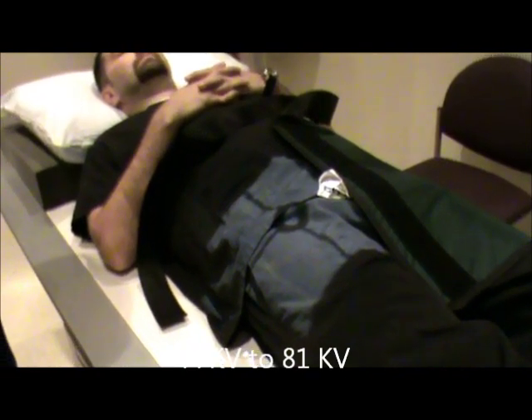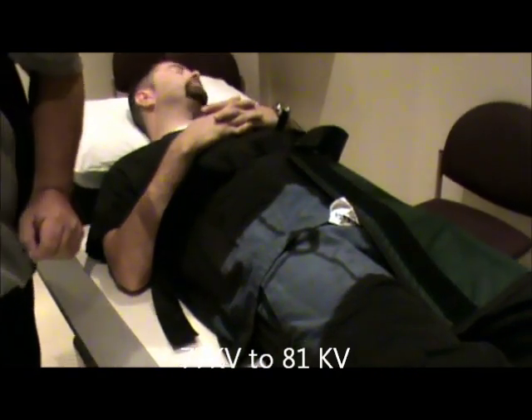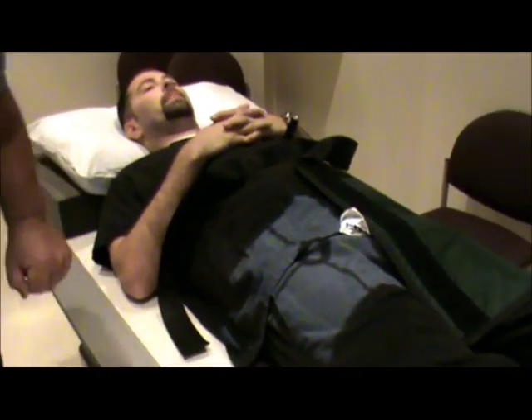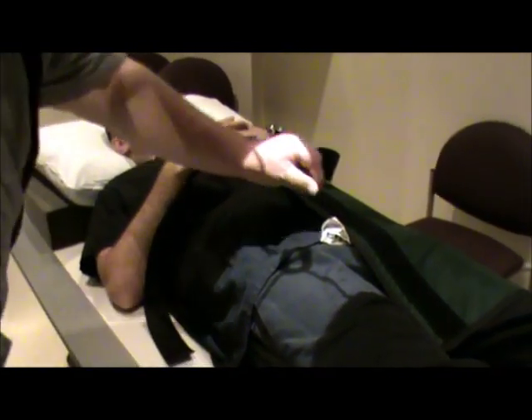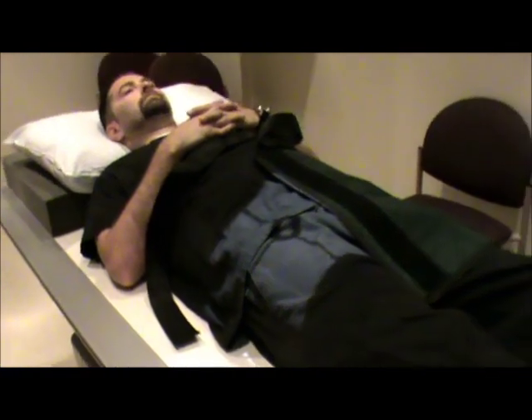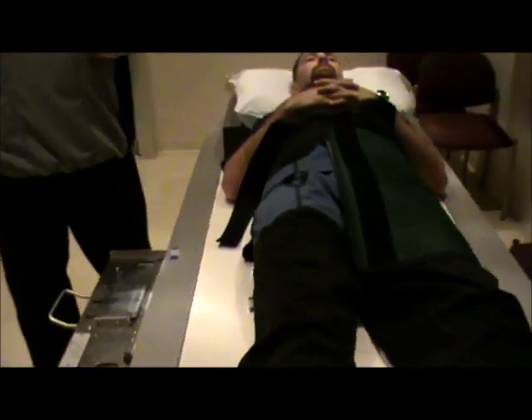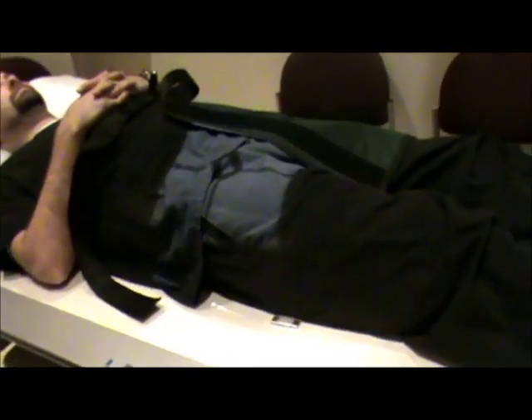The technical factors are going to be 77 to 81 kV, and again film size is going to be 11 by 14. So now we're going to make our exposure. This is our AP proximal femur. The next one we're going to do, we'll change film.